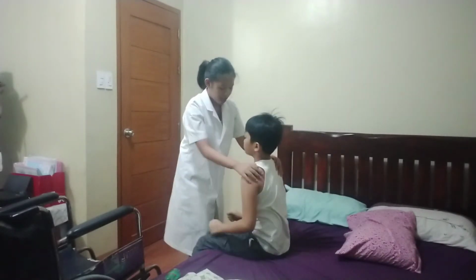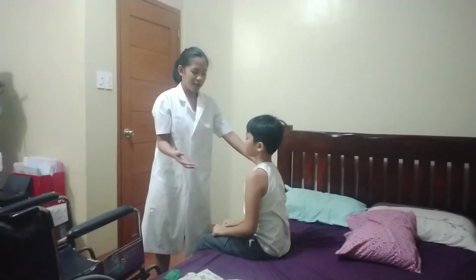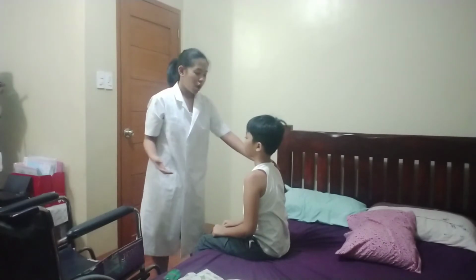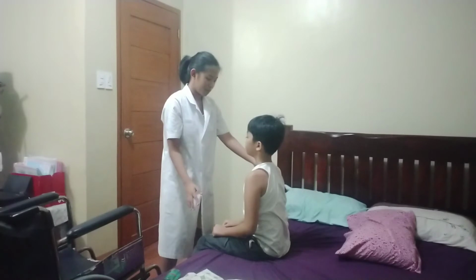Very good. And then I will stand in front of my patient and assess for any balance problems and for any complaints of dizziness. Okay, sir, nahihilo po ba kayo? Okay lang po yung pakiramdam niya?